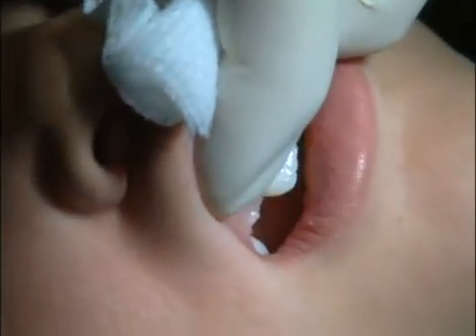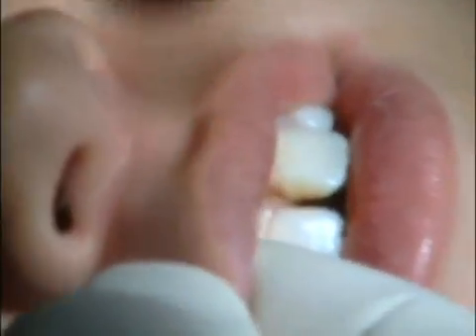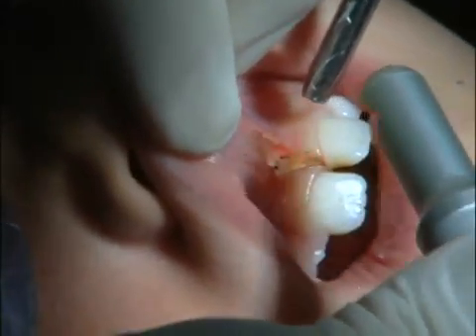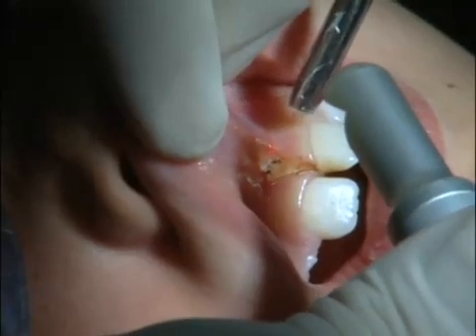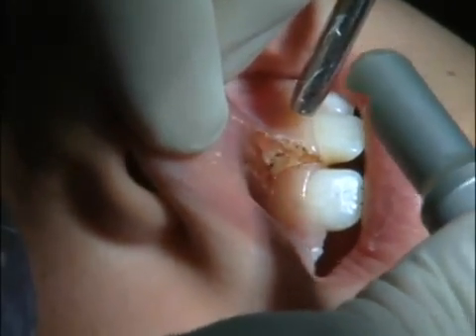Now I'm going to go in and just lighten my setting a little bit, and I'm going to sand the tissue around the cut — just lightly shape it. I'm going to go in just a little bit.